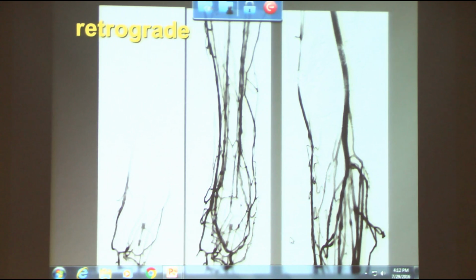And we have really good uniform filling of all the veins, so I like this technique. But this is what I was referring to. If you look at normal deep veins, you see all these little valved areas every centimeter or so in the deep veins, and less common, but still present in these superficial veins. And just notice this nice, smooth, tapering shape of the femoral vein.